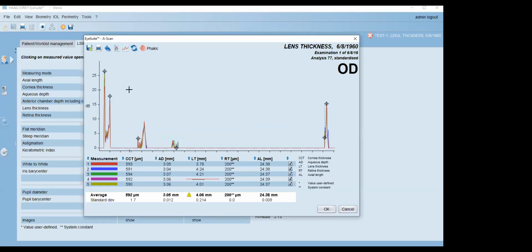Now, an interesting way to look at this is how it happened in chronological order. So I'm actually going to remove all of the scans except for the very first scan that we took. So this is the first scan taken by the Lenstar, represented in red. Now watch these gates as I add the additional scans in, and pay close attention to this gate here.